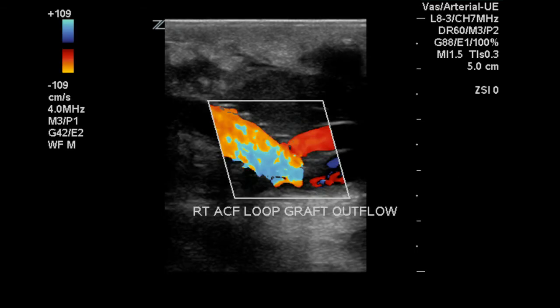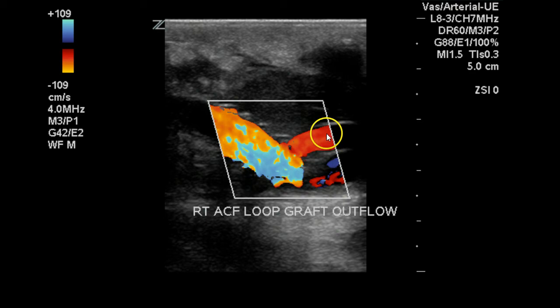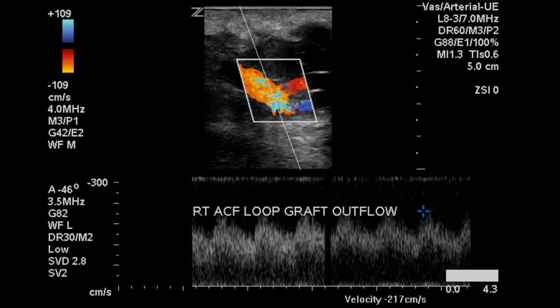At the outflow of the graft, which, considering this is a loop graft, is likely the brachial vein. We can see flow here from the graft into the vein, again with the same flow pattern.